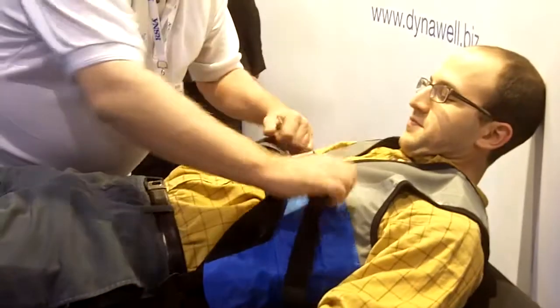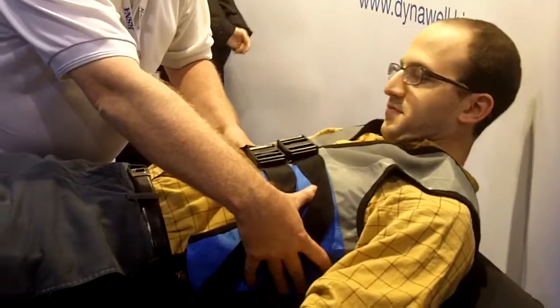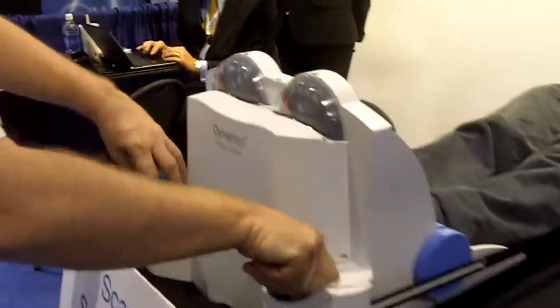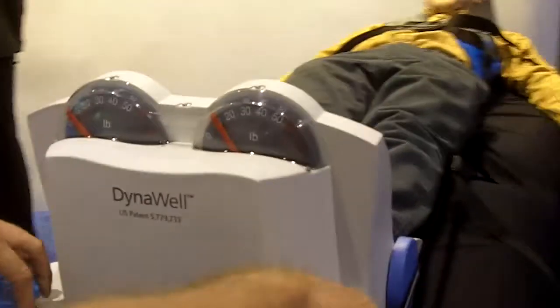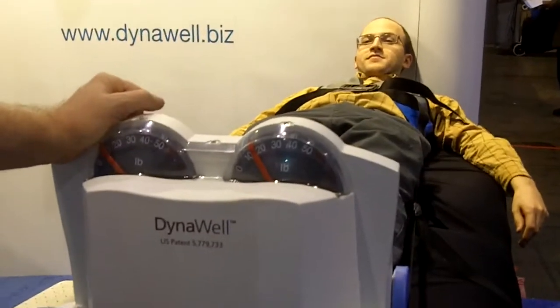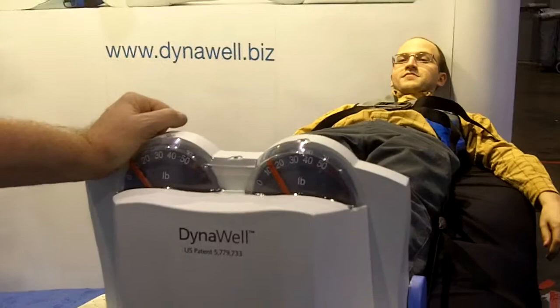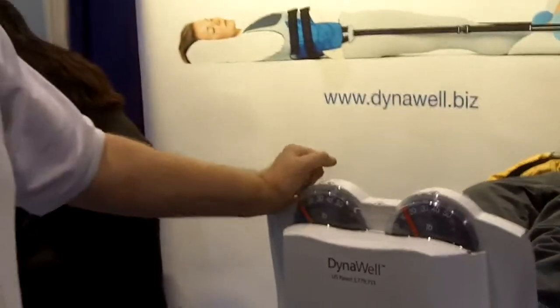You tighten the vest across the chest area, because you want the chest to feel most of the compression, not the shoulders. Then by simply turning the knobs, the dials will adjust to as much pressure as the spine is actually reading. When you reach the desired weight on the patient, you leave it and do a conventional MRI. The difference now is you have the same symptoms as the patient has when he's standing up.